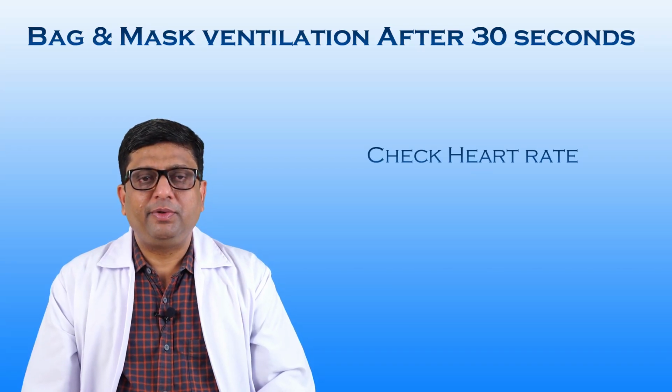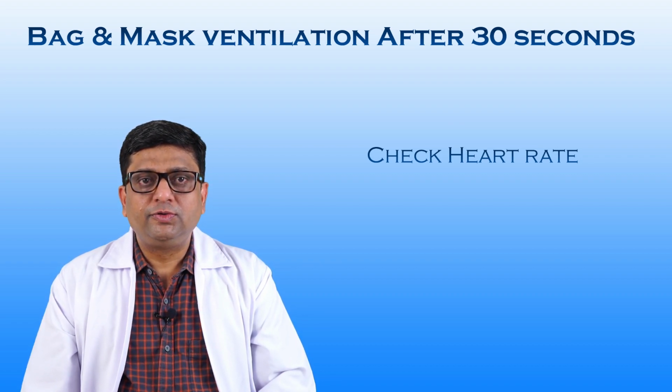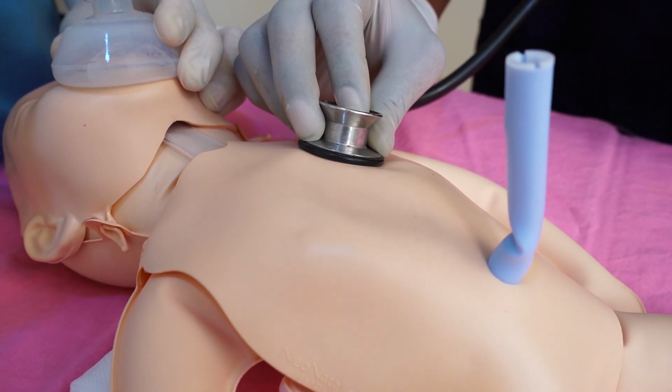Evaluate the heart rate of the baby. For counting the heart rate, use a stethoscope. The stethoscope is to be placed on the left side of the chest.